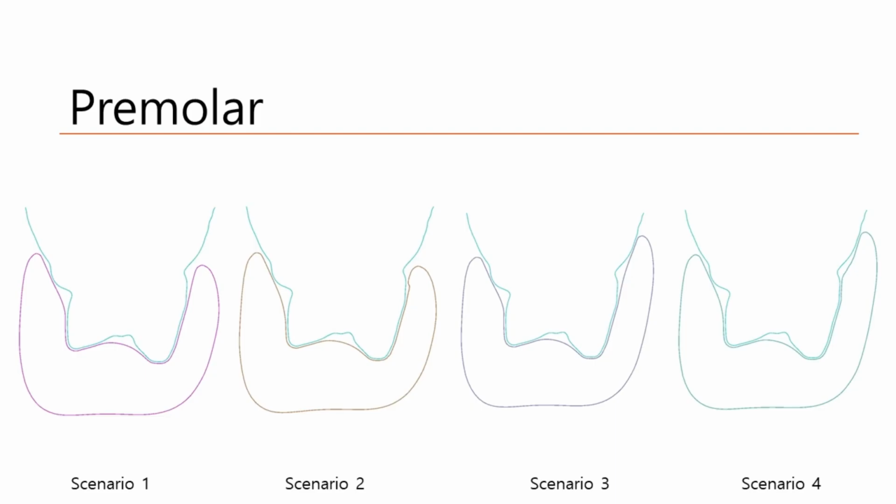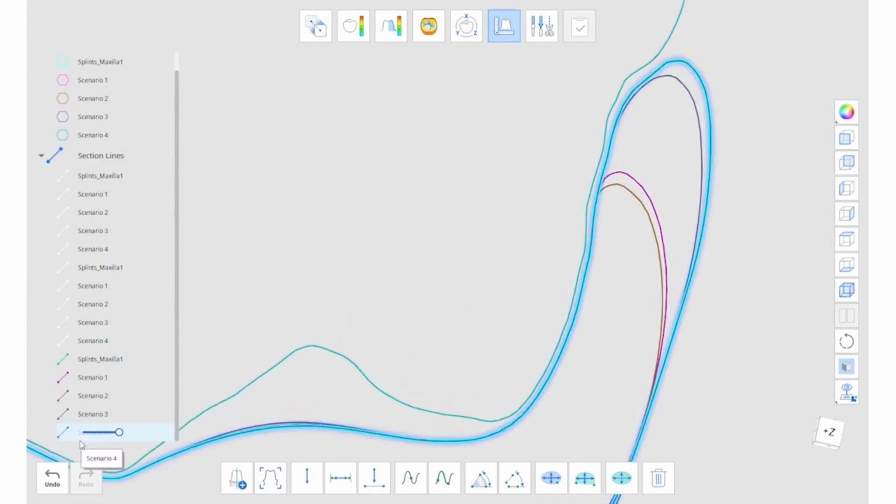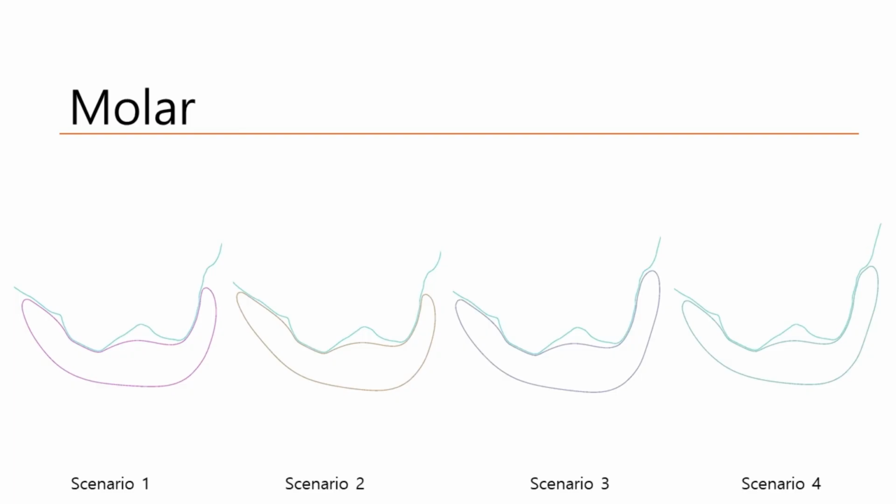The takeaway from our research is the critical importance of meticulous planning in the design of dental splints. Achieving even undercut distribution and ensuring that the margin line includes these undercuts are fundamental to optimizing the retention of dental splints, ultimately contributing to improved patient comfort and therapeutic outcomes.